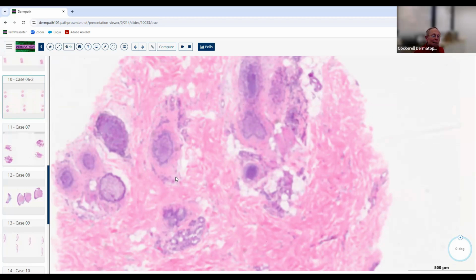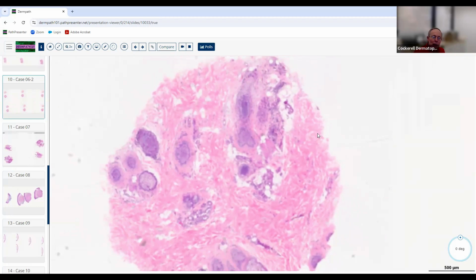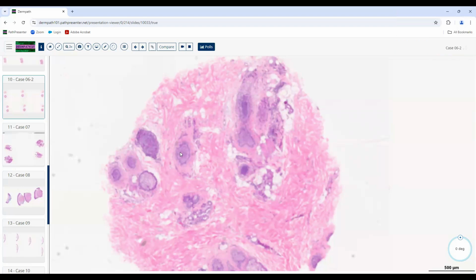And the other way is when it's sort of like an invasion, where something comes in and just trashes everything. It's follicles, dermis, there's diffuse scarring. For example, in folliculitis decalvans, that's basically just like Russia going into Ukraine. It's scorched earth, destroying everything. Whereas if it's sniper shots, it's blasting the individual follicles and leaving everything else alone. That's like in planopilaris, for example. More common with discoid lupus, although you can get interstitial inflammation with lupus, where you get involvement of the dermis and the epidermis between the follicles.